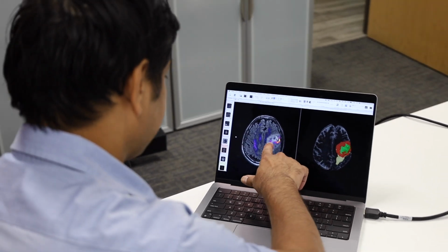So those are your inputs. You need those 4 sequences, which are pretty much standardly acquired on brain tumor protocols and most any sort of brain MRI. Typically, you get those 4 sequences. So those go in. We have about 700 cases from about 20 different institutions that are used to train the model, and as with most tools these days, it's using a convolutional neural network.